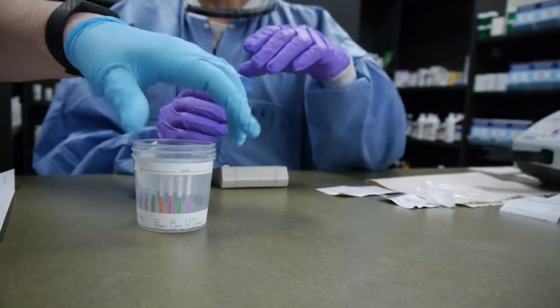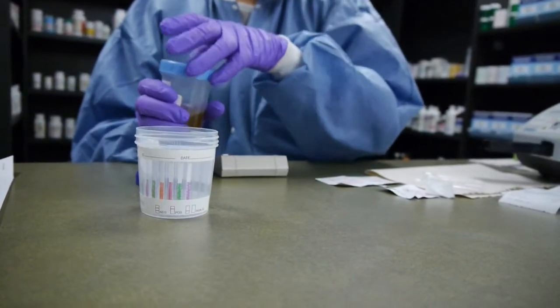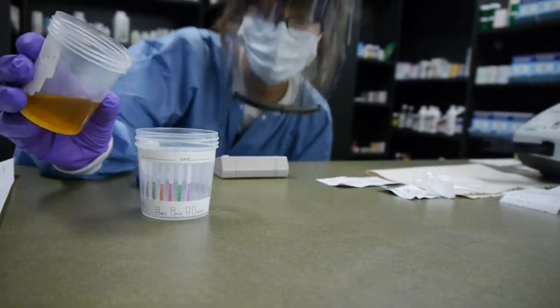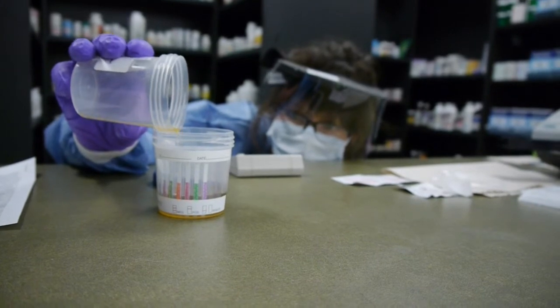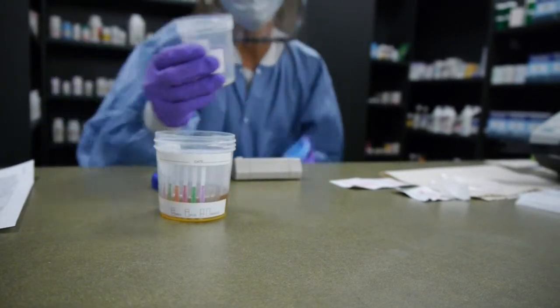She's going to add 30ml or at least 30ml. There's a temperature gauge that would verify the temperature, that it was fresh urine that just came out of the person and not from somewhere else.